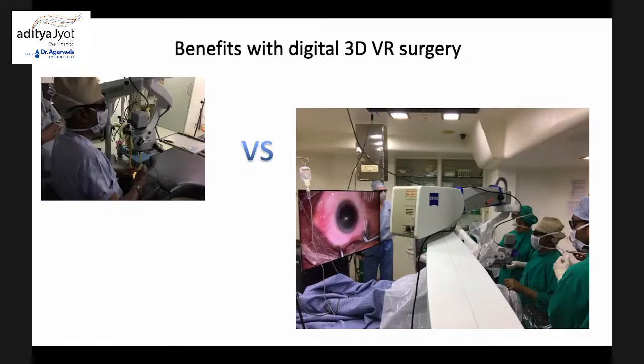doing. So the only thing here is, in the beginning, I think in the 80s when we were operating, only the surgeon could see whatever you're doing, and the fellows like us when I was at Banaras, we could see, but not exactly the same as the surgeon, through the assistant microscope. But we'd be holding the contact lens.